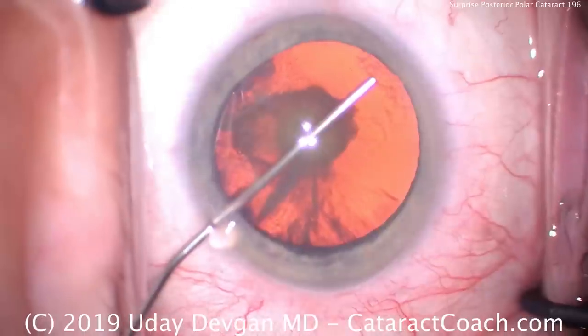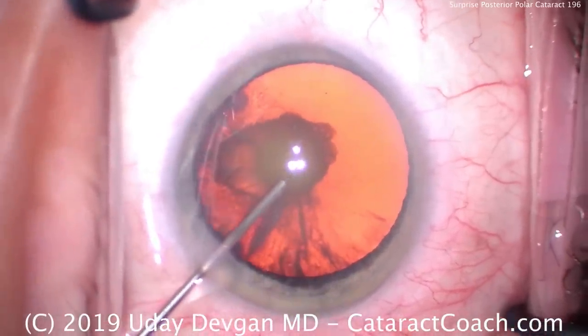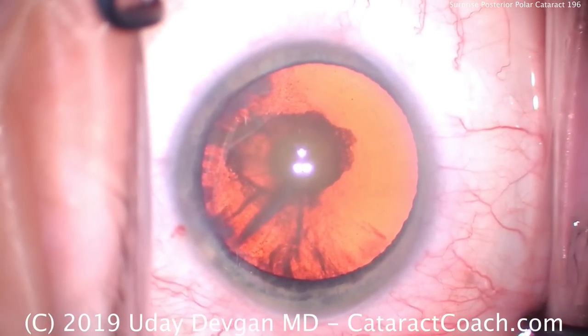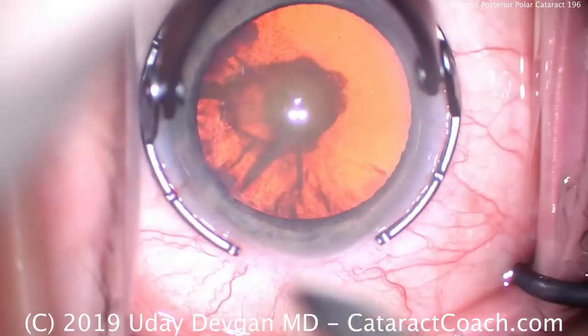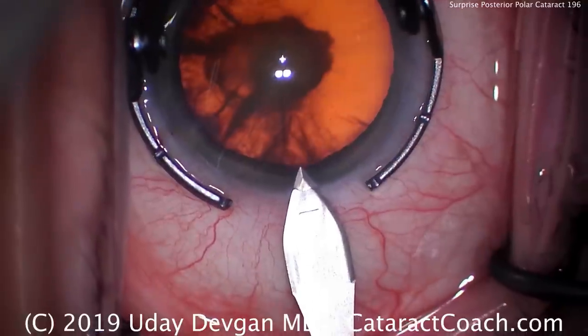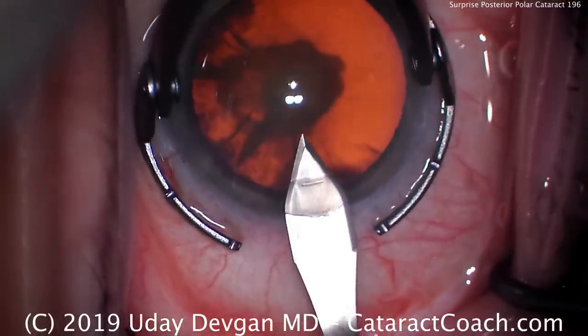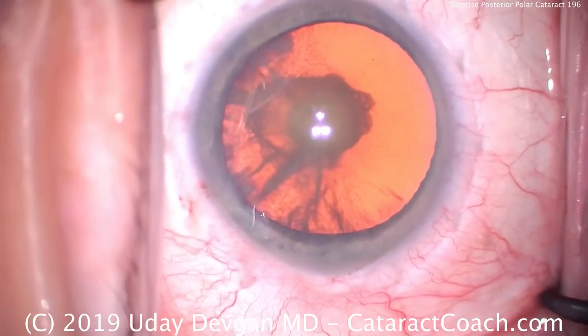Sure enough, when we look at the chart, this patient has been noted to have a posterior polar opacity for many decades. This patient is now 67 years old and is having cataract surgery, but certainly has had this posterior polar cataract essentially her entire life. The opacity has become worse, and we're at the point now where we need to do cataract surgery in order to improve her vision.